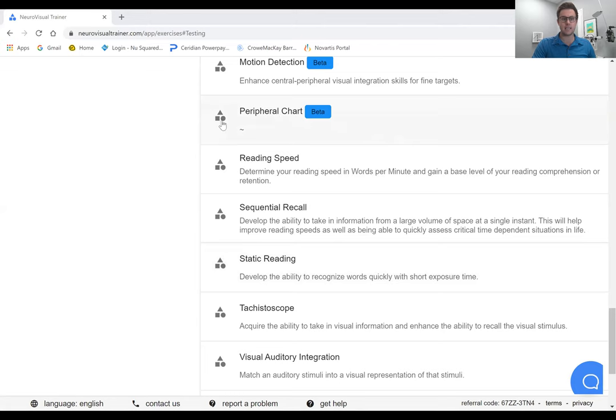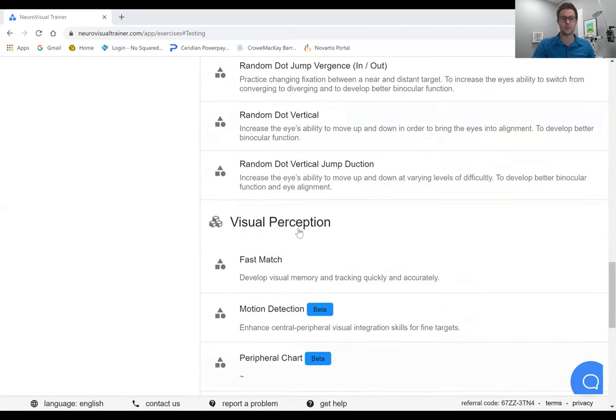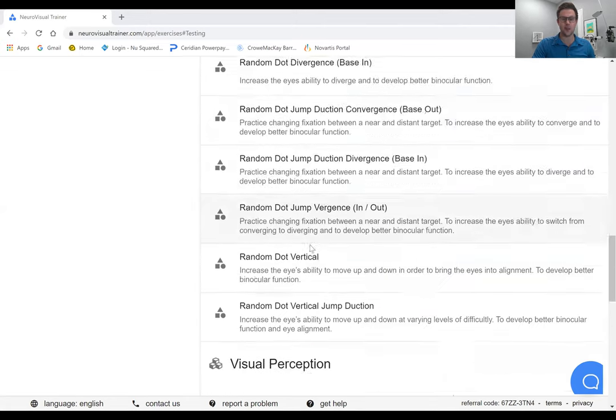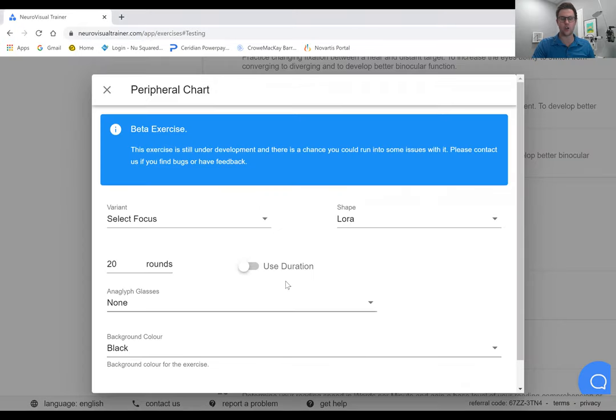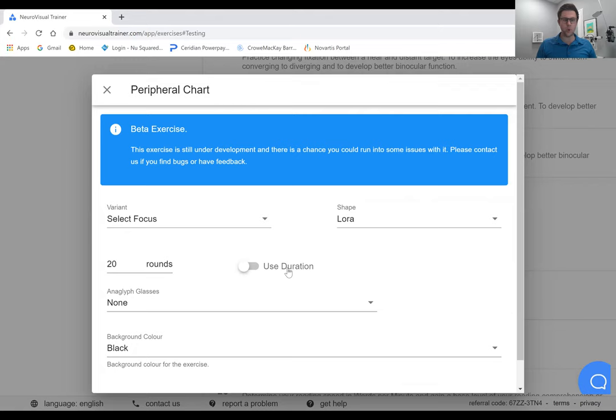Inside the exercises there's a new activity called a peripheral chart. We've all seen these peripheral awareness cards but one of the really nice elements here is there are a variety of different ways that you can set it up.